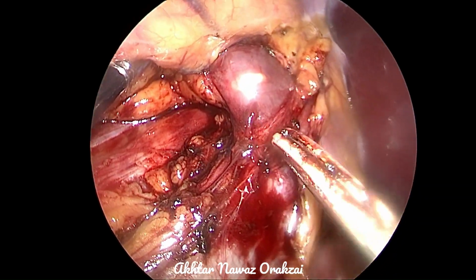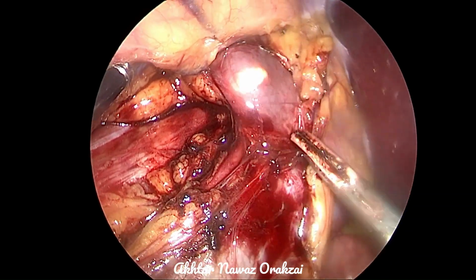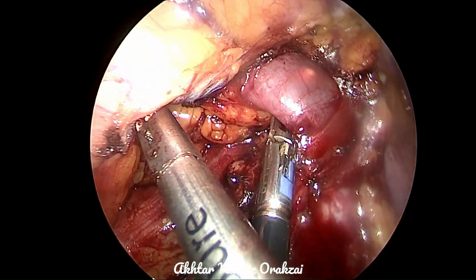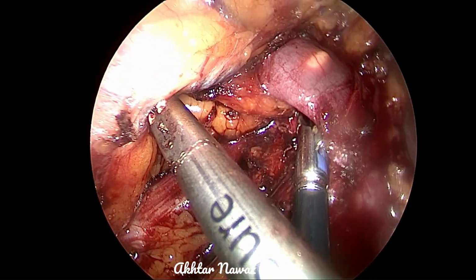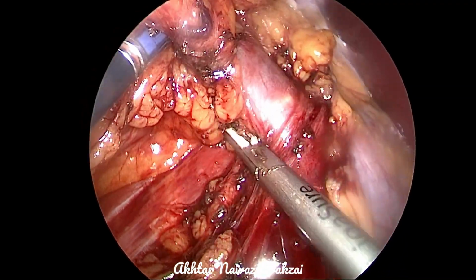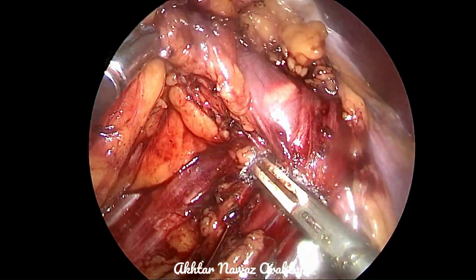Now we dissect this vein, this one, yes. So I can't even clip it. I can't cut it and coagulate it with the LigaSure. The only thing would be to sew it or stitch it with the Prolene, which again is a cumbersome thing.